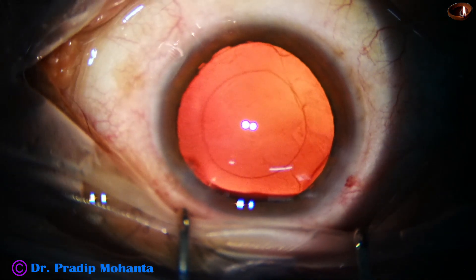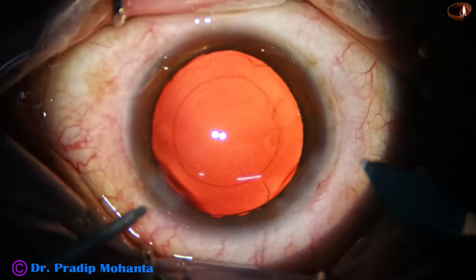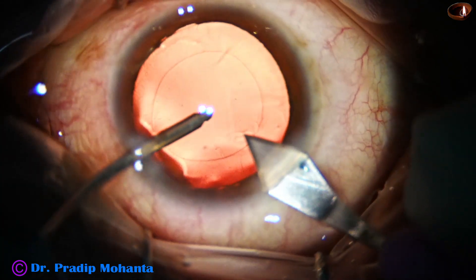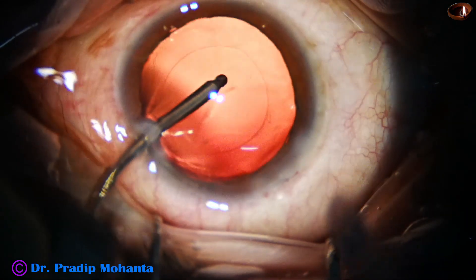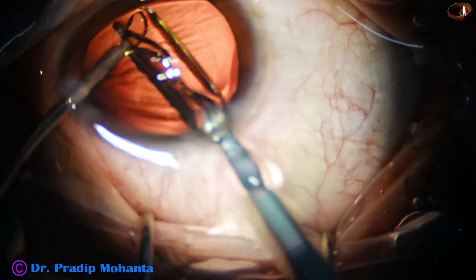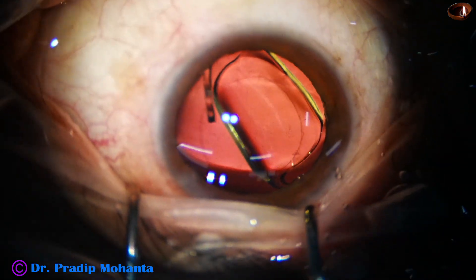Now I am going to implant an intraocular lens. I am going to use a B cartridge, enlarging the main wound to about 3 millimeters — initially the wound was 2.8 millimeters, now enlarged to about 3 millimeters. Here it goes: the single-piece hydrophobic aspheric intraocular lens, a monofocal intraocular lens.